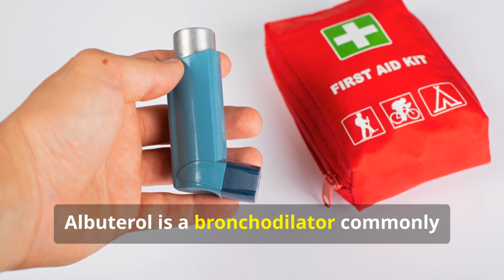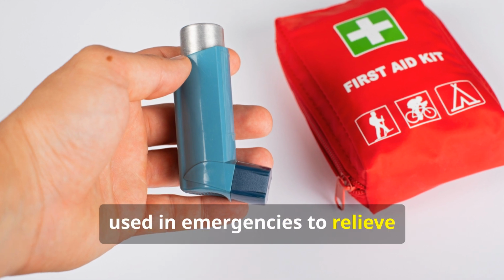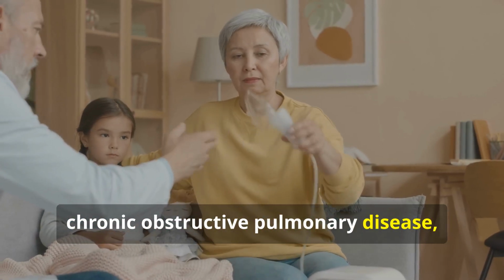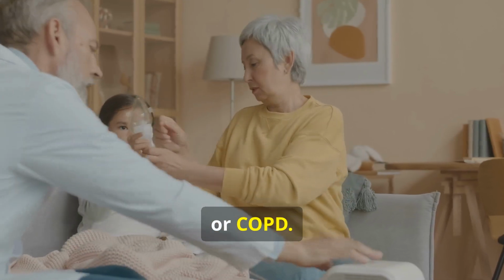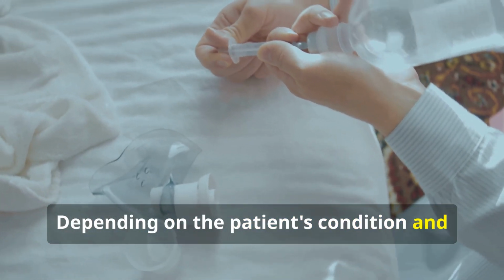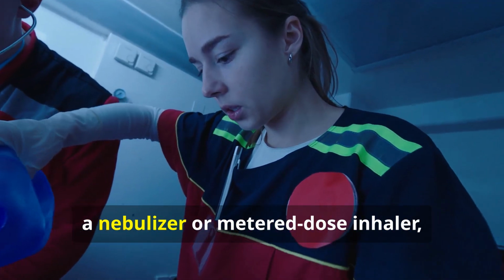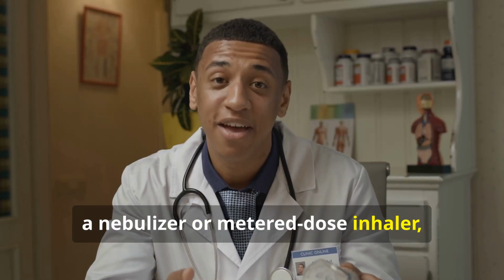Albuterol is a bronchodilator commonly used in emergencies to relieve bronchospasm in patients with asthma or chronic obstructive pulmonary disease, or COPD. Depending on the patient's condition and response to treatment, a paramedic may administer albuterol via a nebulizer or metered-dose inhaler, or MDI.